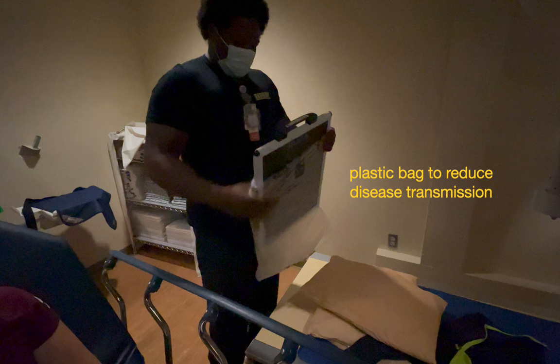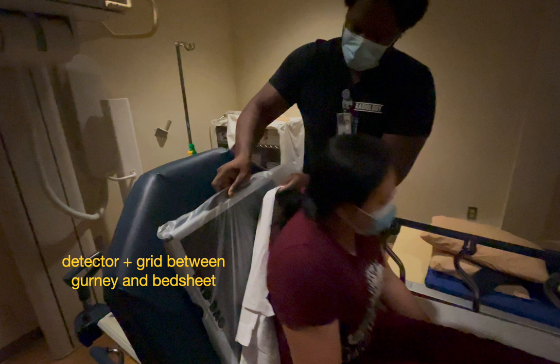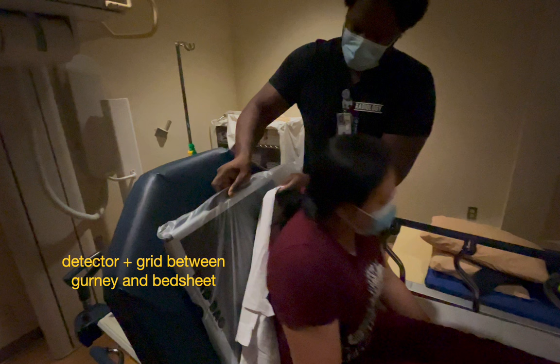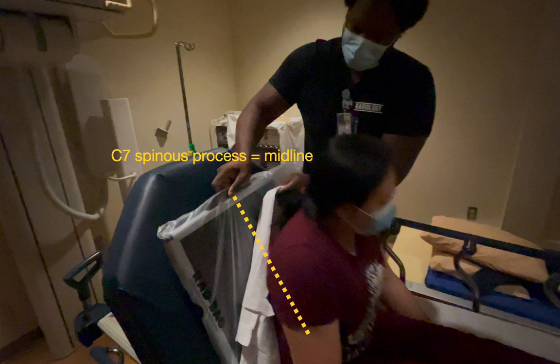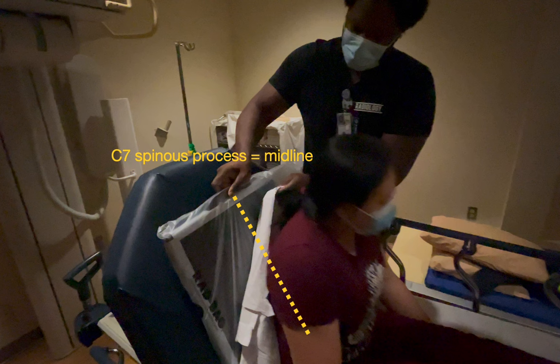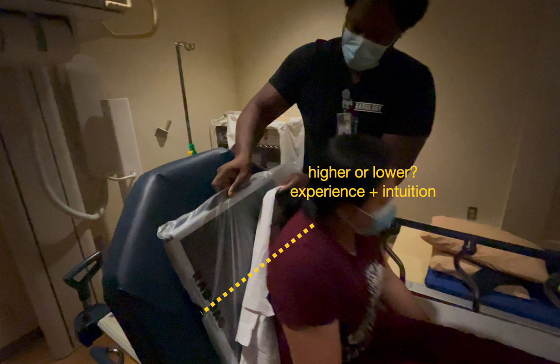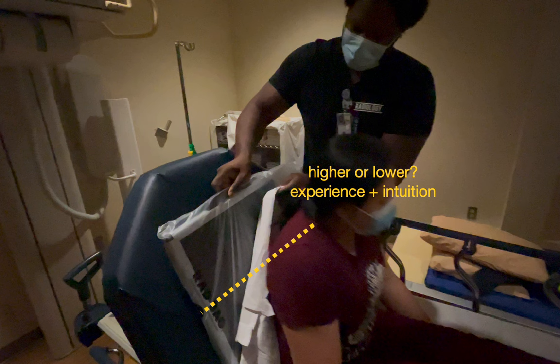The x-ray tech will place the entire assembly into a plastic bag and place it behind the patient between the patient's gurney and their bedsheet. It's important that the detector can capture both the patient's lungs completely. The x-ray tech will make sure the panel is properly centered using the spinous process of the patient's C7 vertebral body as a marker for midline, and use their intuition and experience to make sure that the detector isn't too high or too low relative to where the patient's fully expanded lungs may be.